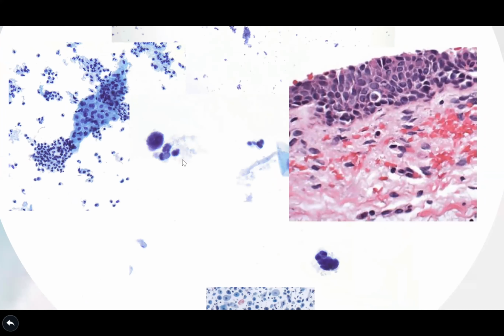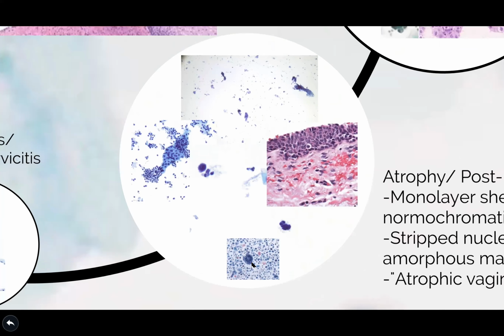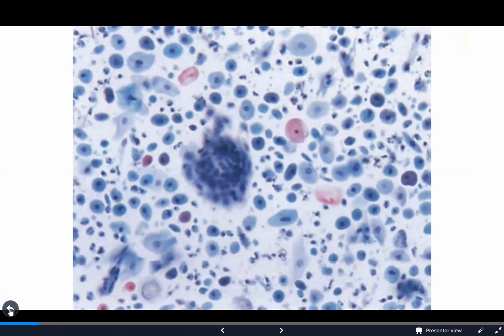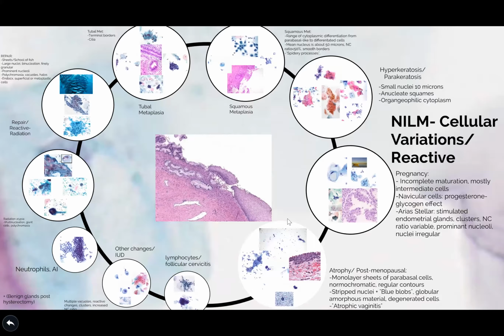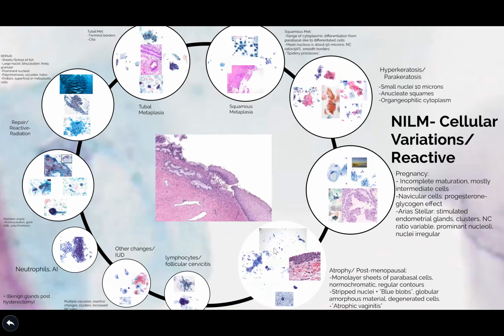Here are the parabasal cells that we were talking about. It corresponds to very compact cells without much layering or maturation. Once again, this picture was from before, where it shows there are different levels of maturation, but not a lot of the superficial cells that you would expect when there's a good amount of maturation. The other thing is it looks kind of empty. If you look at it from far away, it's empty, lots of blue. So that would be menopause or atrophy. And like I said, if there's inflammation, you would call it atrophic vaginitis.